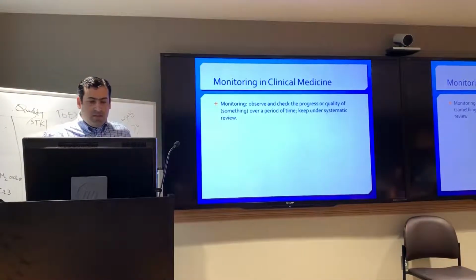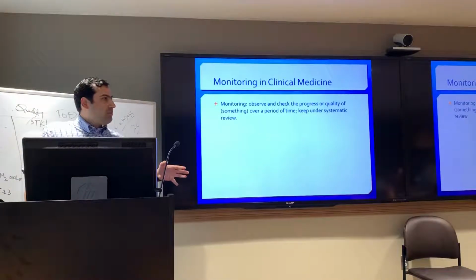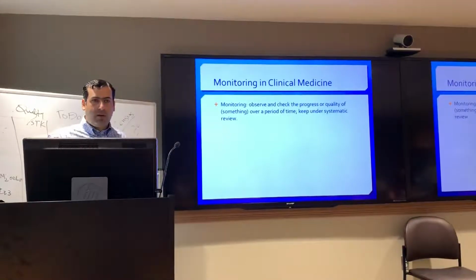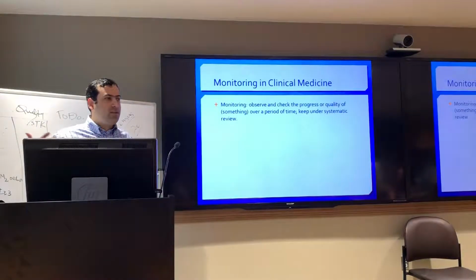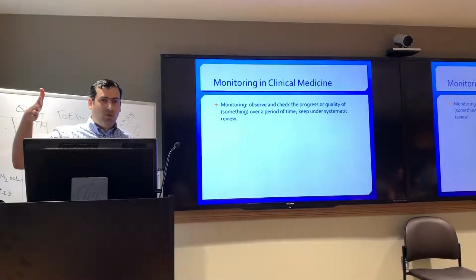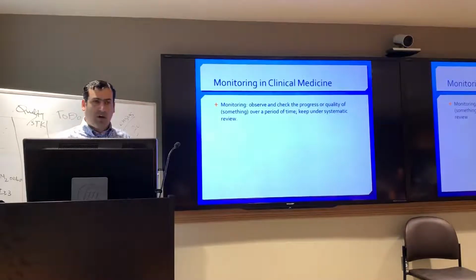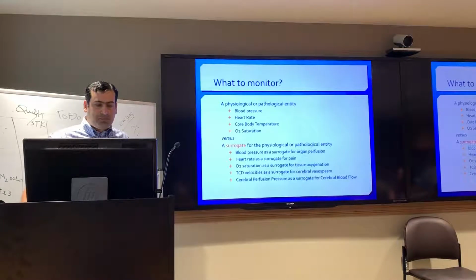Okay. Yeah. So you monitor and you observe something over time and see what happens to that. So that's monitoring. That's important to know because a lot of the stuff we do are not fitting into this paradigm. So we're not following something or we're not doing it over a period of time. And so, for example, for PbtO2 monitoring, you probably have noted that many times when we walk into a room, we ask if we can connect the probe to a Moberg monitor because that gives us an idea over time. And without that, we really do not fulfill the criteria of monitoring. We just see things in snapshots.